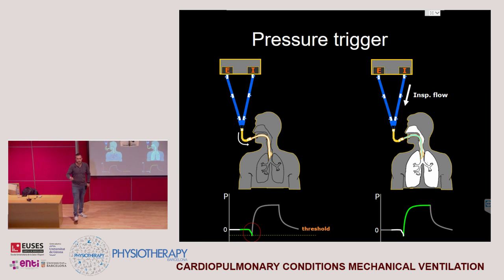So at that time, the ventilation unit will deliver a cycle. It means that if, for example, it is set at 15 times 500 milliliters, and the patient does not perform any effort, the ventilation unit will deliver 15 cycles of 500. But if the patient performs one effort, the ventilation will have delivered 16 times 500 milliliters. Two efforts, 17 times. Okay, so it's an addition. It's a cycle addition. Yeah?